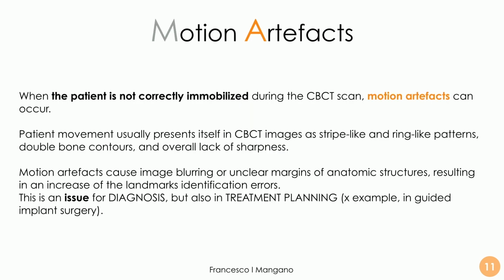When the patient is not correctly immobilized during the CBCT scan, motion artifacts can occur. Patient movement usually presents itself as a stripe-like or ring-like pattern.